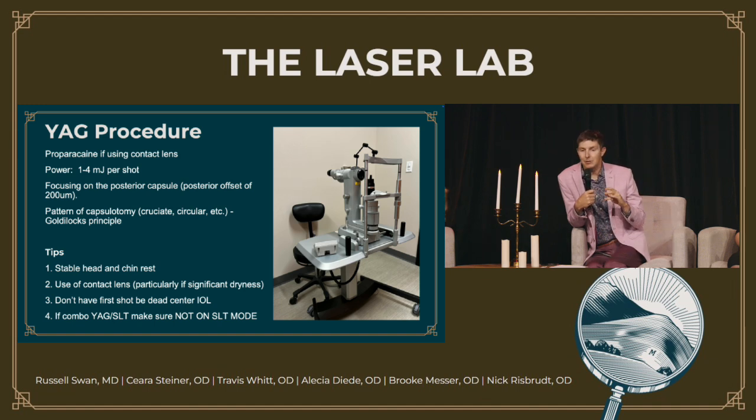The pattern of capsulotomy, I think, is dependent on doctor preference. Lots of people have different thoughts on it. A cruciate would be like a classic cross pattern, and we'll see an example of that. And then you can also do a circular pattern, and there are variations of that.